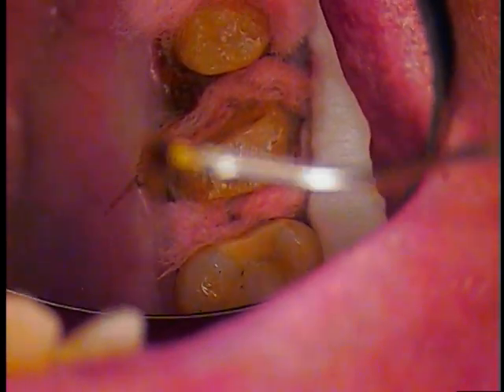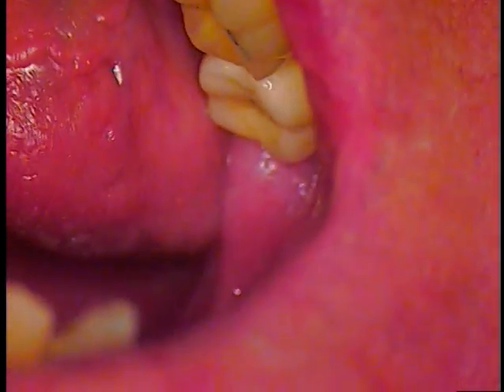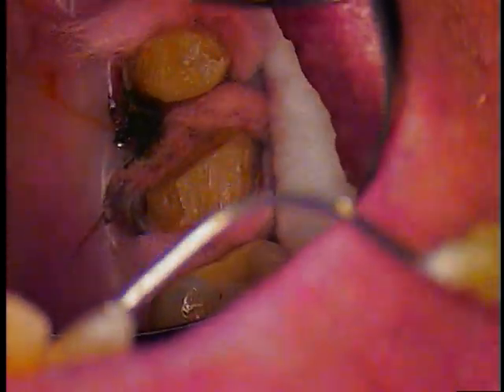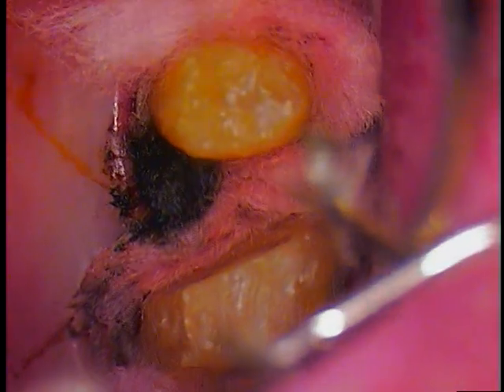That's the next step — astringent. The tips are exchangeable, disposable — put a new one in. So we've got to get that better. It's starting to coagulate; you can see how dark that is. We'll rinse that out and double-check everything is clear sailing in that zone. Now we put the siltrax in underneath the pink cotton. That'll remain in there when we go to cement — the pink comes out, siltrax stays in. We'll cement right on top of that. Six minutes cement time, then we'll clean out the cement and remove the siltrax.